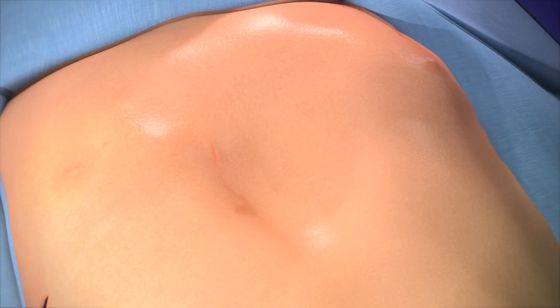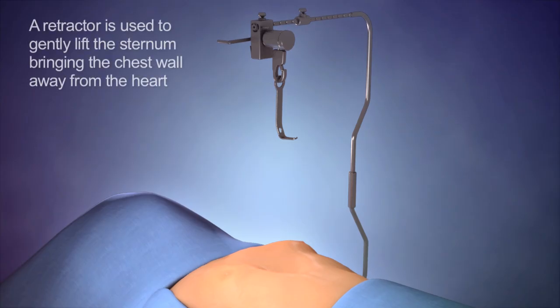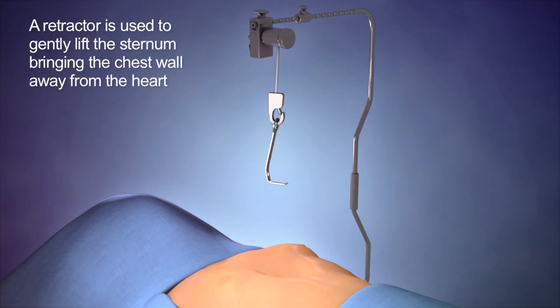To allow for better visualisation and safer passage across the chest, a retractor is placed to lift the sternum away from the heart.